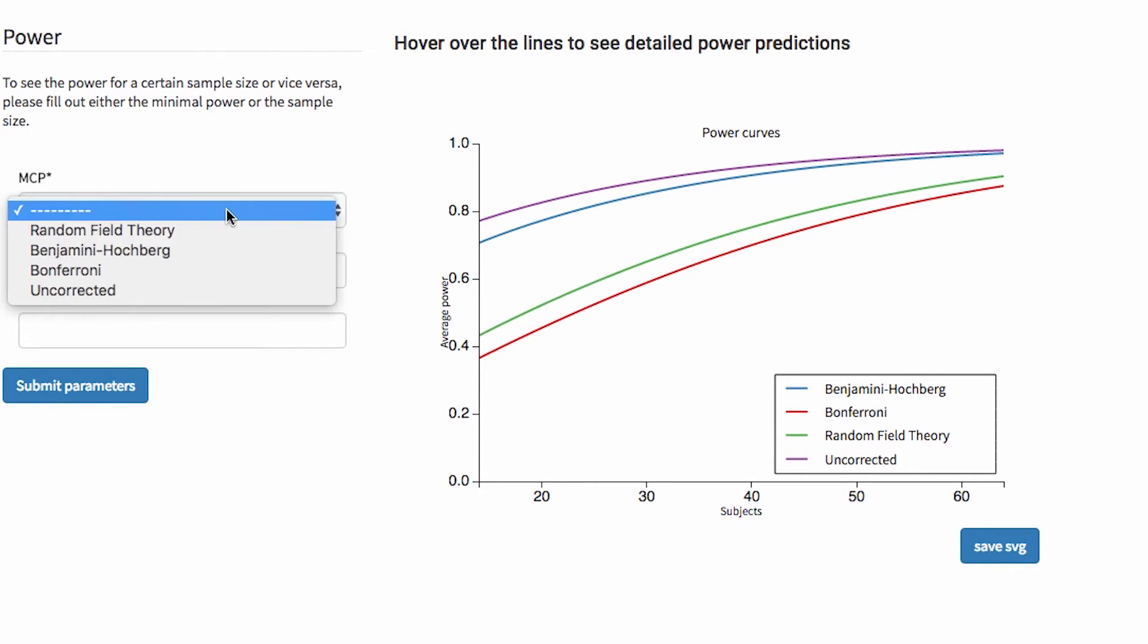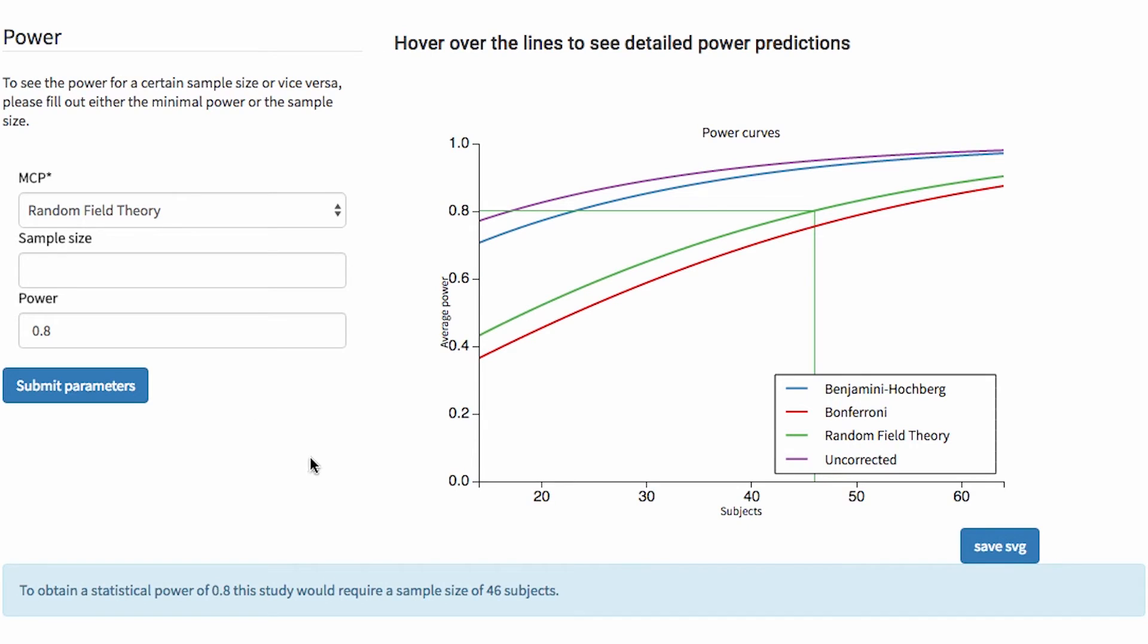So, let's say that I'm planning on using a random field theory correction, cluster correction, and I want to know how many subjects I need in my sample for 80% power. I just fill in those two fields right there, submit parameters, and it will give me a very precise crosshair focusing on what sample size I'll need. So, to obtain power of 0.8, this study would require a sample size of 46 subjects. There you go.